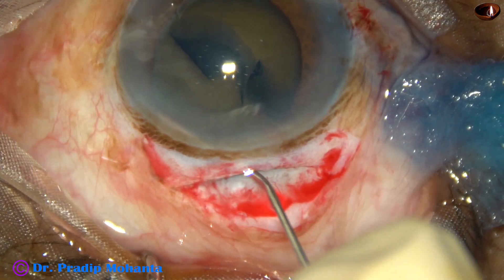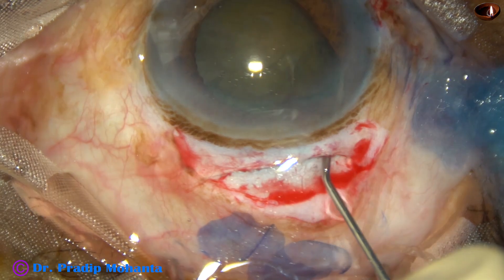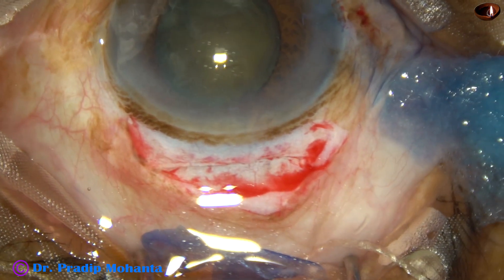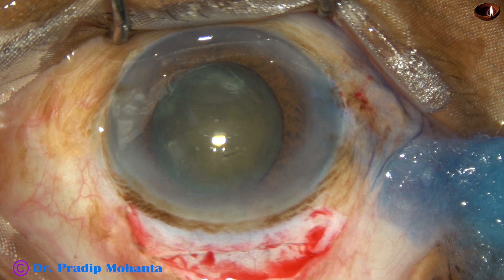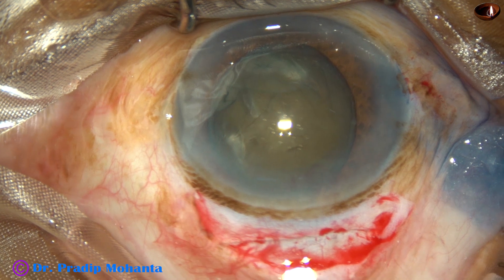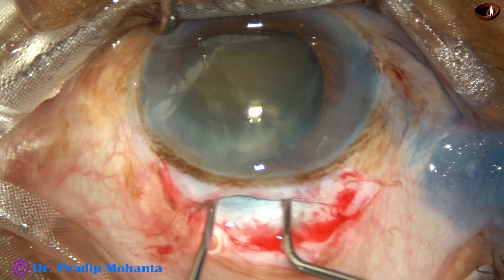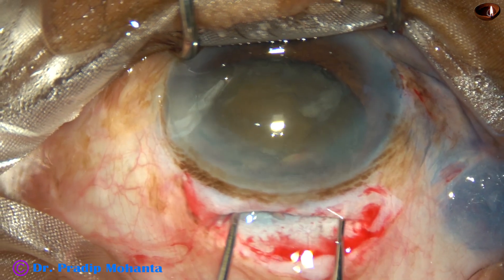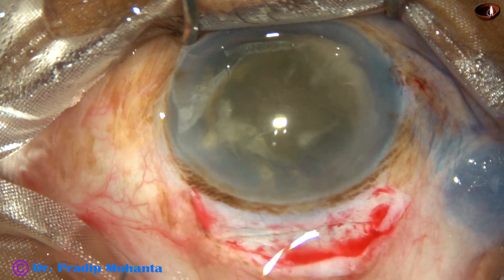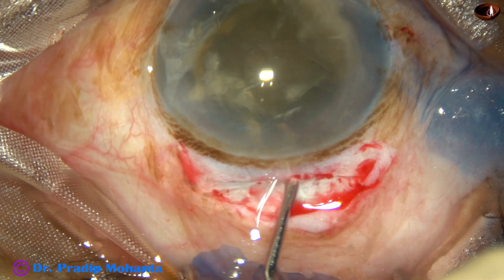Now, hydrodissection. If the nucleus is a little small or soft, it usually prolapses by hydrodissection. But in this case, it didn't prolapse into the anterior chamber by hydrodissection. So I have planned to make it prolapse by two instruments — a Sinskey hook in my right hand and a chopper in my left. The chopper goes behind the nucleus, the Sinskey hook is in front, and it is rotating, and the nucleus has come out. This is a good technique for prolapse of the nucleus.